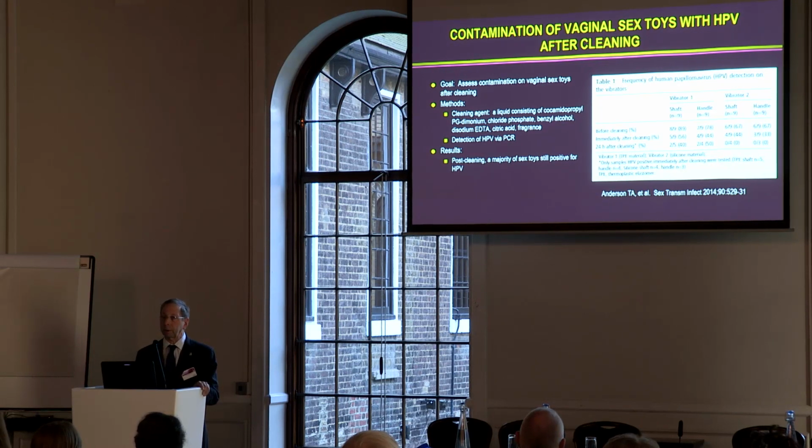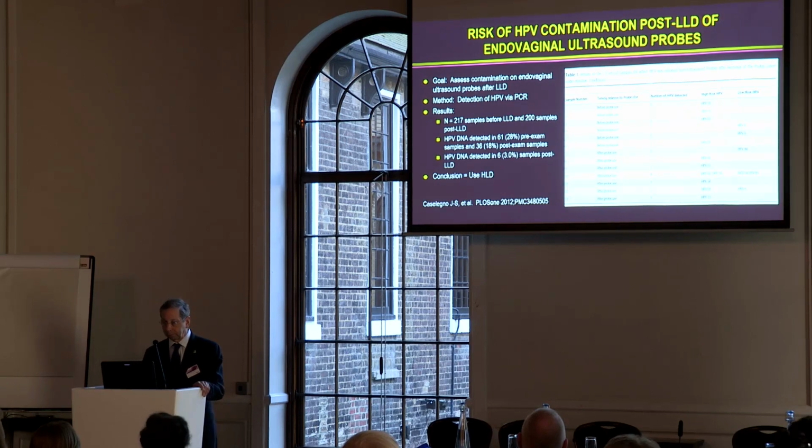HPV is very common in the population, and cleaning and low-level disinfection is just not going to eliminate this pathogen, as we've seen. Probe covers will help, but again, unless one does high-level disinfection, they will not eliminate contamination.